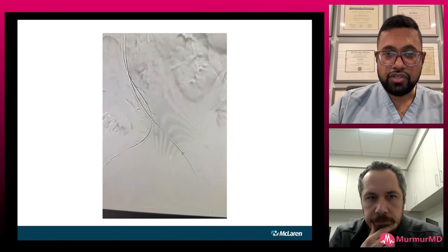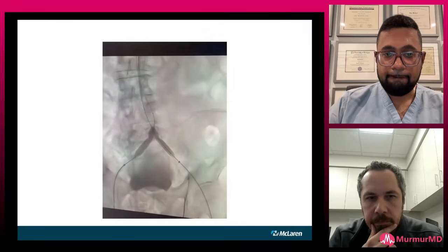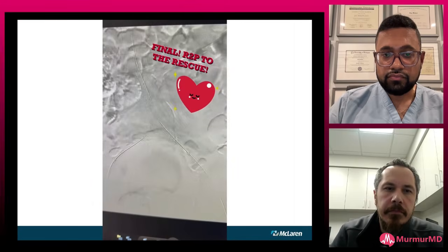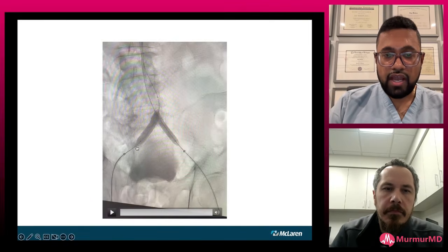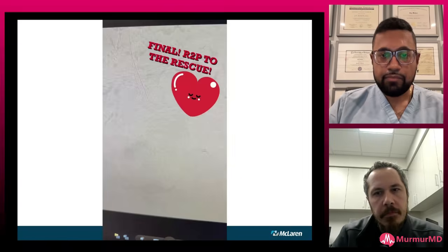And then we do our image here, and we can see we're starting to gain some of that flow back into the CTO iliac. And then here we start by doing our kissing balloon inflation. And actually, I'm sorry, that was the delivery of the covered stents. So I used IVUS to size both common iliac covered stents here. I believe we used 8 mm stents and then post dilated them as you mentioned earlier because I had bilateral 7 French sheaths.